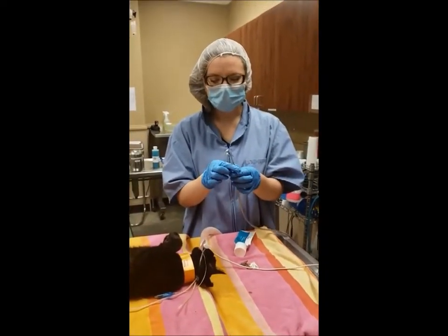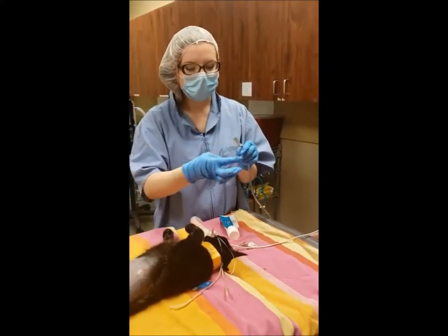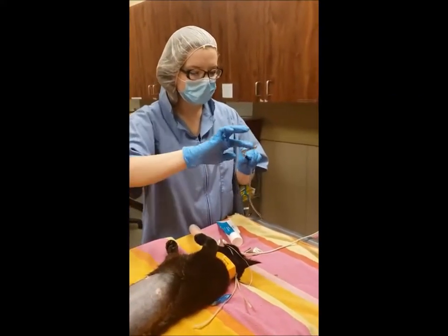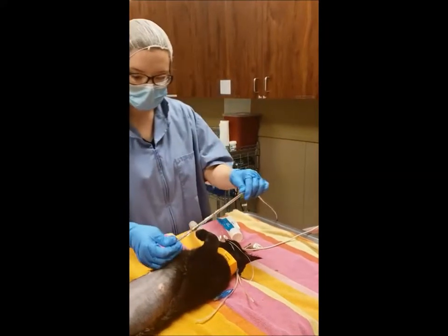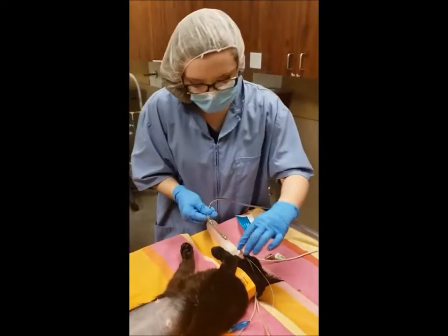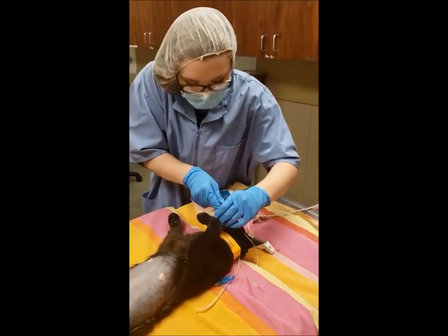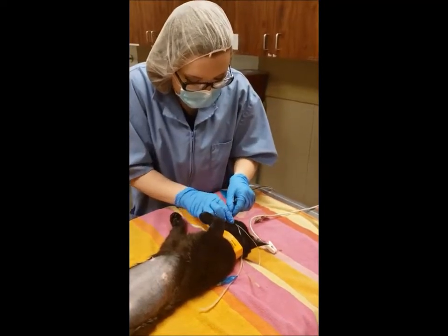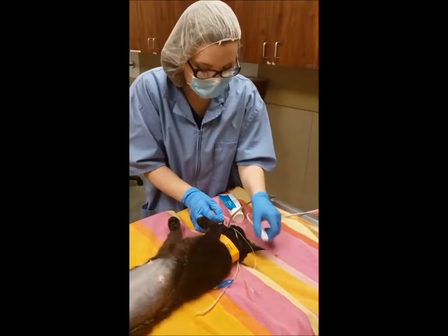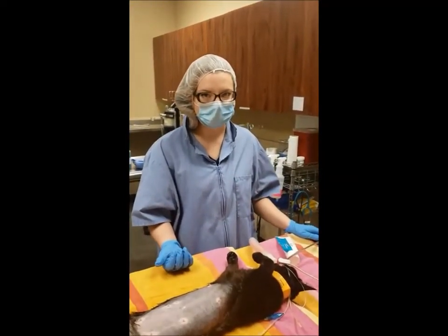Okay, I'm going to place the esophageal ECG probe, and I've got some lube on it. If we had an esophageal stethoscope, we would place this in the esophagus the exact same way. We do not have that equipment here at our hospital, but the concept is the same. So I'm going to measure it, and the way you measure it is you want it to the middle of the thorax, right above the heart. And so you place this in the left side of the throat, and you want to make sure that you're very gentle, so you do not want to damage the esophagus. And this is going to monitor her ECG, so the electrical activity in the heart, and it will also monitor her respiratory rate.